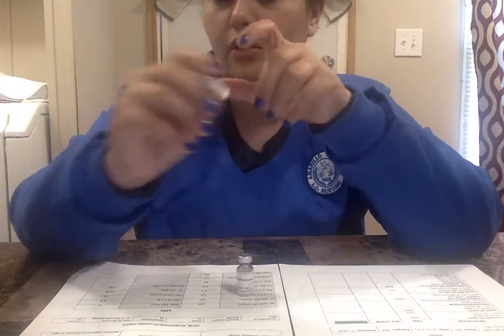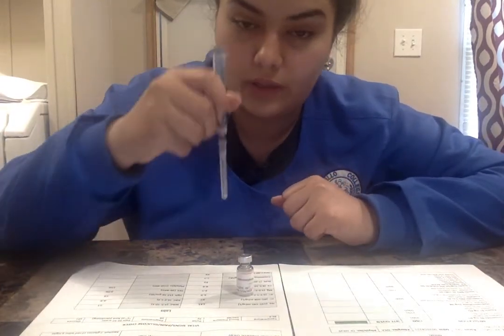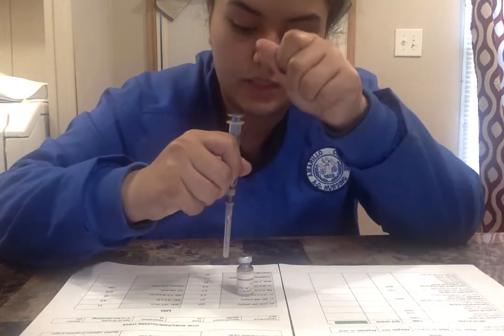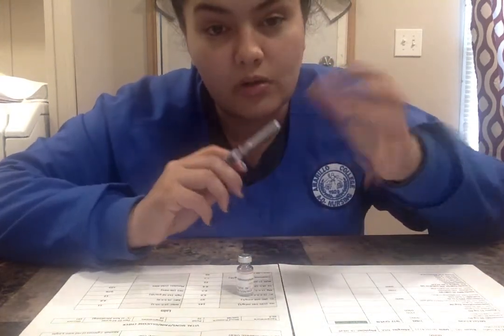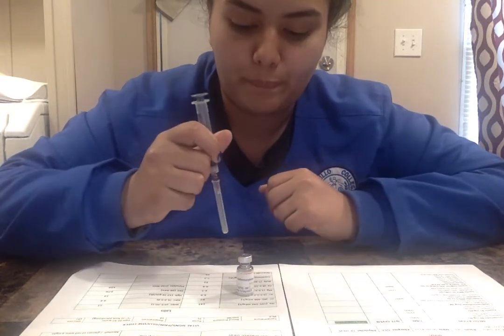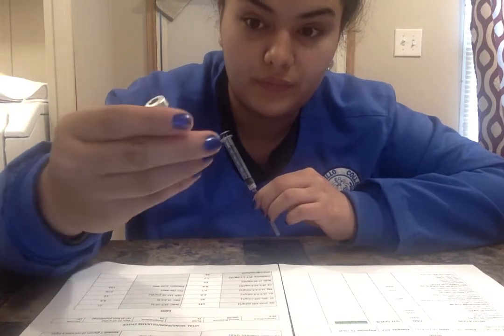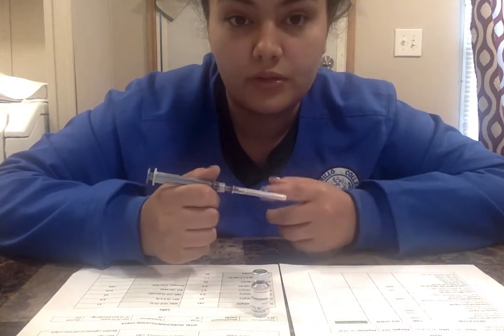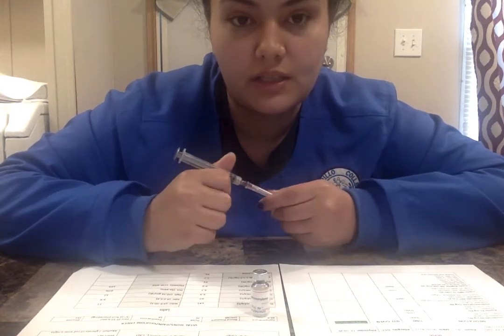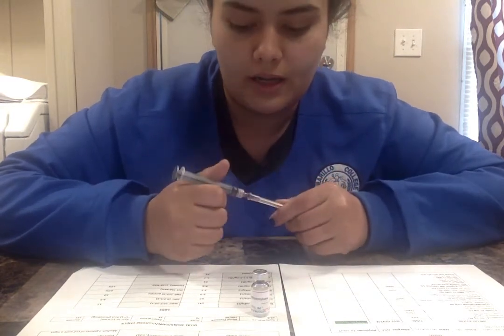Next, if this was a real glass bottle, we would draw the medication like this, because you wouldn't want to invert a glass bottle because the medication would just spill everywhere and defeat the purpose. But since this is a vial, I'm going to have to invert it to get the medication out, and this can be tough, especially since this is a filtered needle. I don't know if that has anything to do with it, but it makes it really hard to draw this medication, so I might struggle a little bit.